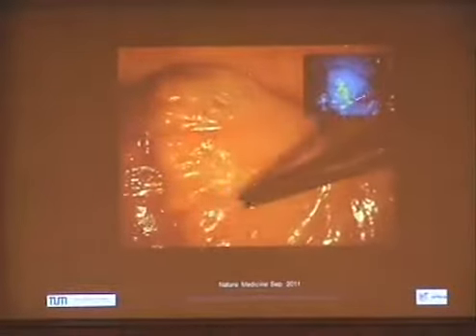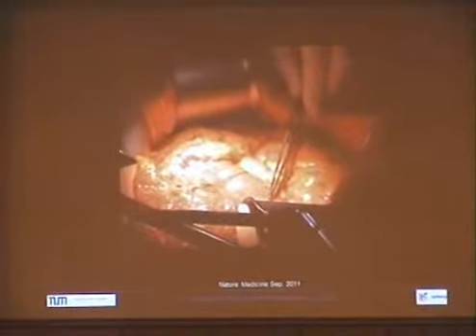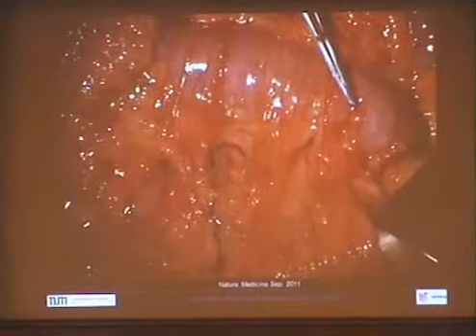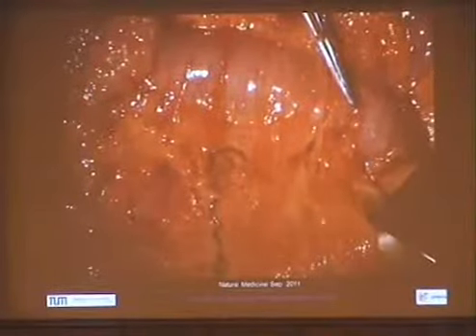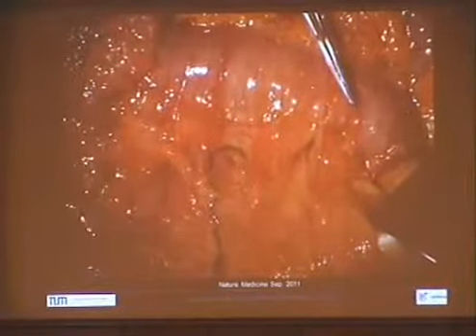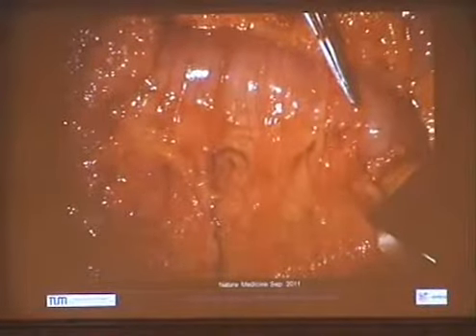And you can see you can do this. This is just a visualization. This is the fluorescence image. This is the color image. But of course, we can put those together. So I'm just going to show you another case. This is, again, another patient from the same group of patients. Again, a folate receptor positive, an ovarian cancer positive patient. And there's a nodule here.